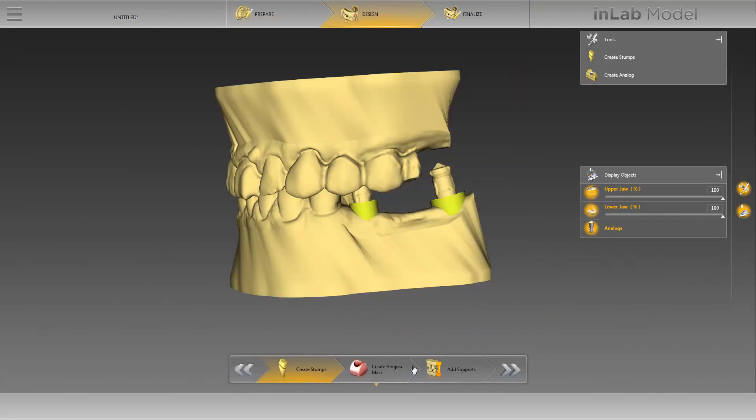In this phase, we'll run through the Complete Step menu. In the step Create Stumps, there are two tools available. The option Create Stumps can also be used in an implant case if the model includes implants as well as prepared teeth. As our case includes only implants, we'll switch to the option Create Analog.